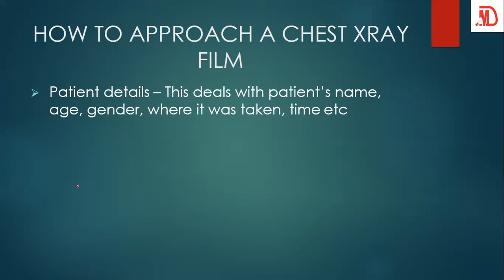Okay. For example, an X-ray that was taken like a month ago would definitely look different from an X-ray that is taken maybe today. Same patient, it will be different. So you have to be able to know when the patient took that X-ray. It's very important so that you don't go and give drugs you're not supposed to give. Okay. So the first thing.